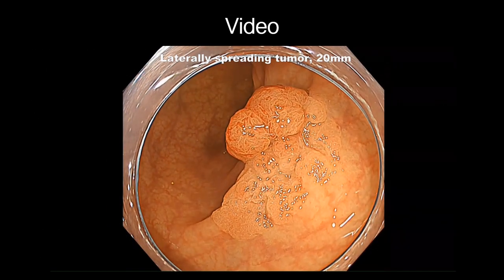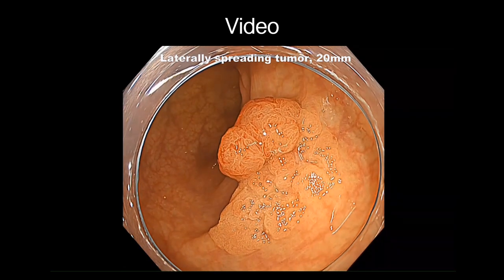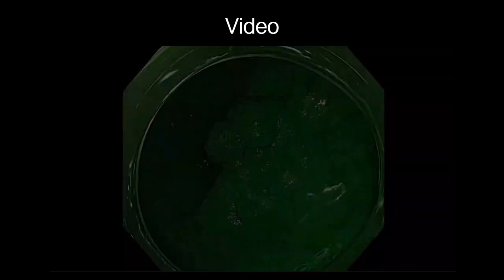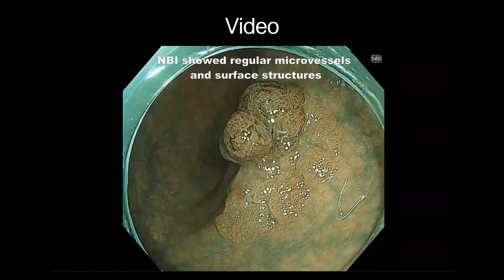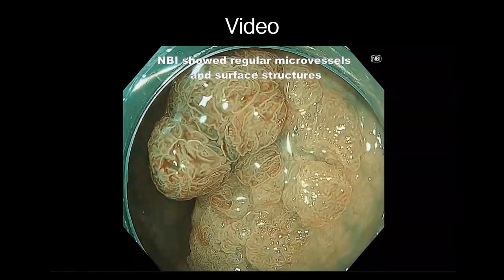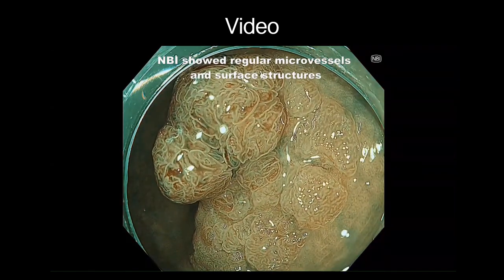White light imaging showed a laterally spreading tumor with a diameter of 20mm in the sigmoid colon. Magnified endoscopy with narrowband imaging showed a regular microvessel and surface structure, suggesting an adenoma.